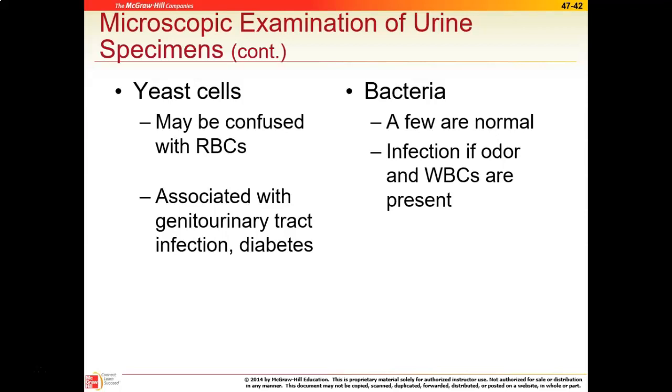And once again, we kind of mentioned odor. Odor can be a little bit more noticeable if somebody has a lot of bacteria and/or white blood cells present, okay? But we don't usually mark that on our sheet.